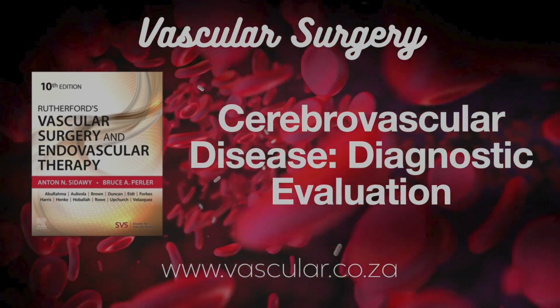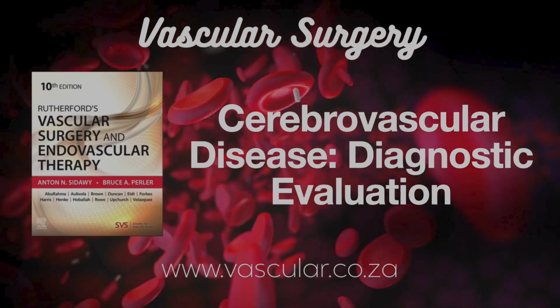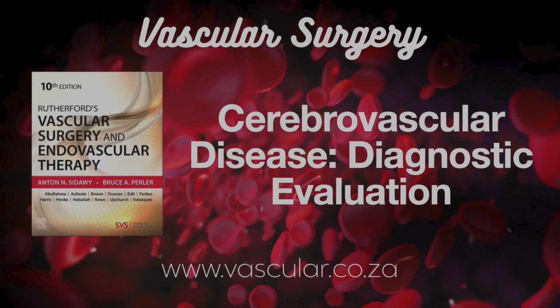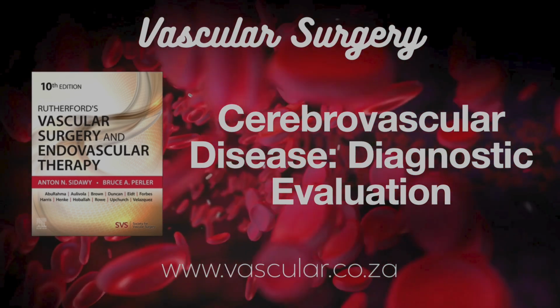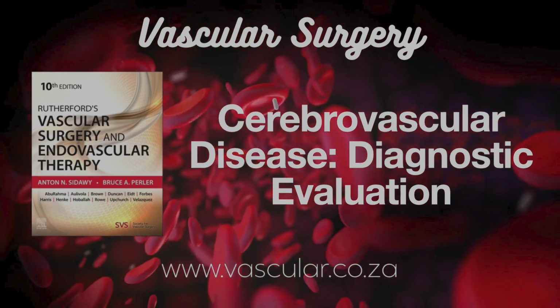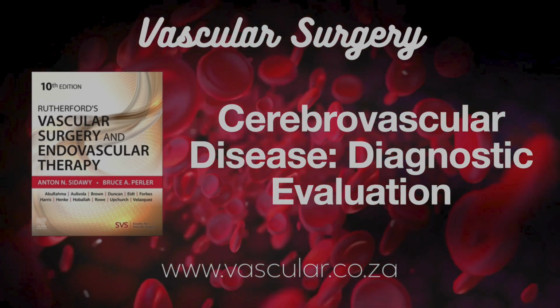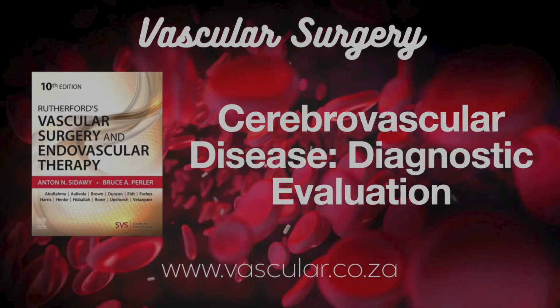With TCAR, the aortic arch details are less important because you're accessing the carotid directly in the neck, but the CTA is still essential. You absolutely need to know about the planned common carotid access site. How deep is it? Is there plaque or heavy calcium right there? Because you have to puncture it. Precisely. Heavy calcification at the access site is a major no-go for TCAR. You also need detailed info on the ICA further up and the intracranial circulation. CTA helps select the right patients for TCAR and avoid potential complications.